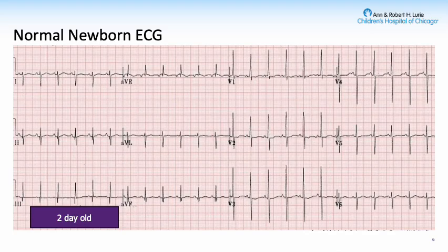And then this axis changes as newborns age. So at around a month of life, you expect a QRS axis of about 90 degrees. And then when kids are around 3, they're really in the inferior axis realm and they should be around 60.